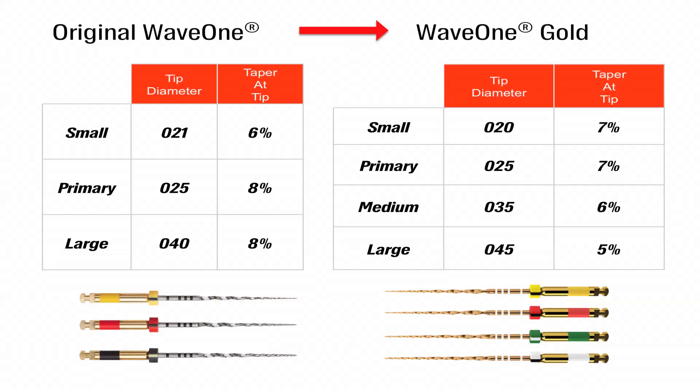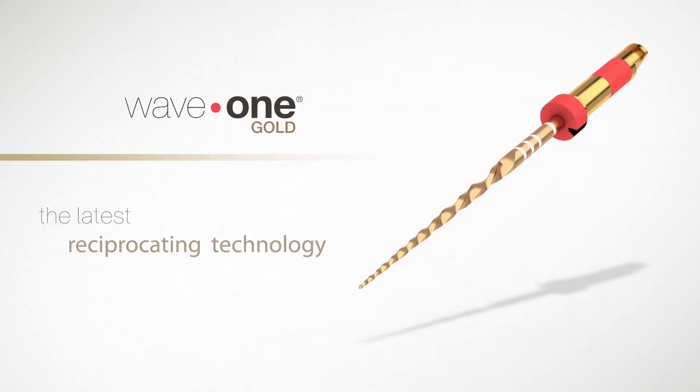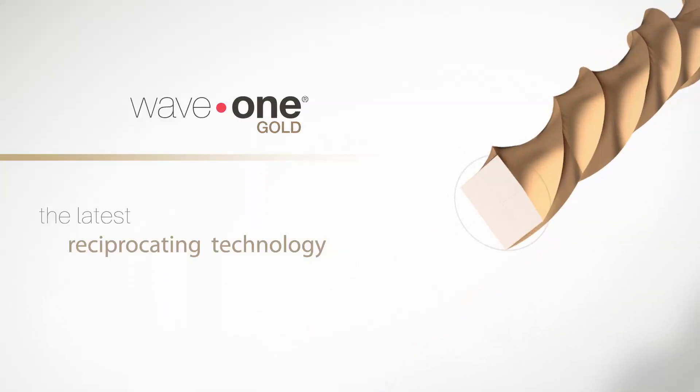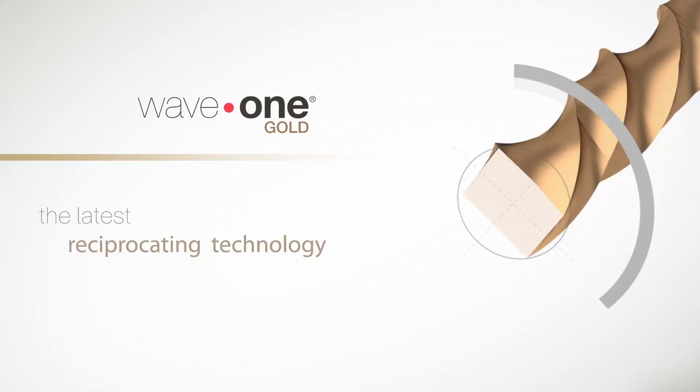To understand my excitement, let's review some of the aspects of the original Wave 1 file. Wave 1 files are designed to be used in a modified reciprocating motor and handpiece. These are not true reciprocating files that just rotate back and forth. They are used in a modified reciprocating motion where the motor continuously changes its rotating direction during the shaping of the canal.